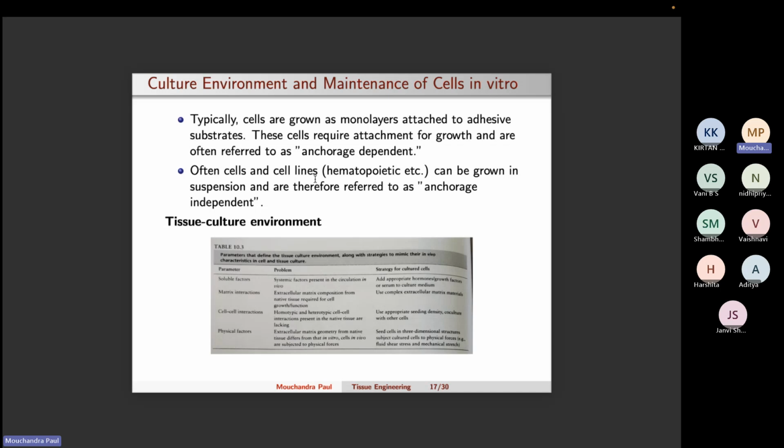So these are the kinds of things that you need to do in order to create a sterile environment. Also, entry should not be given to all personnel. Only people who are familiar with these protocols have to enter. So these sterile conditions you need to maintain.